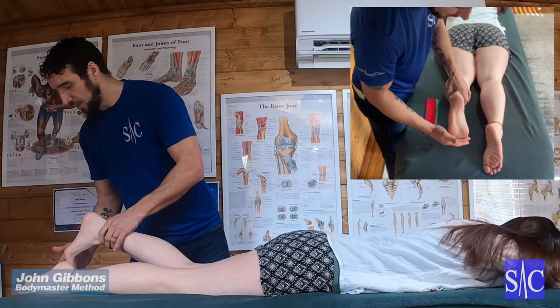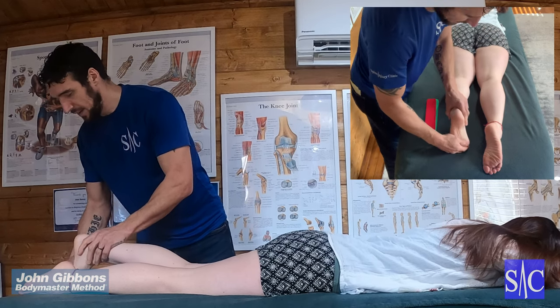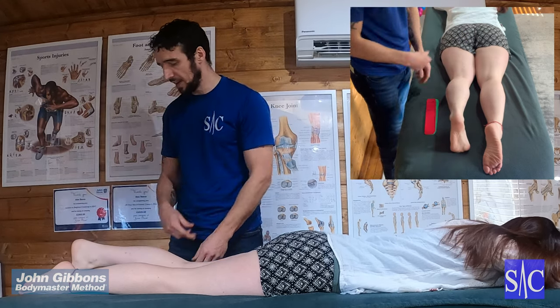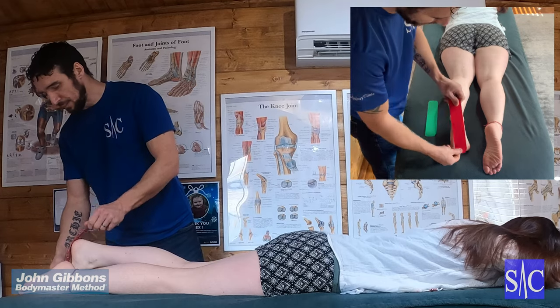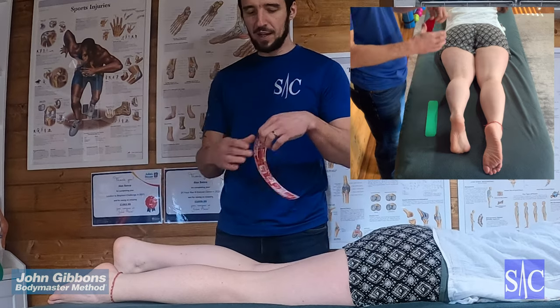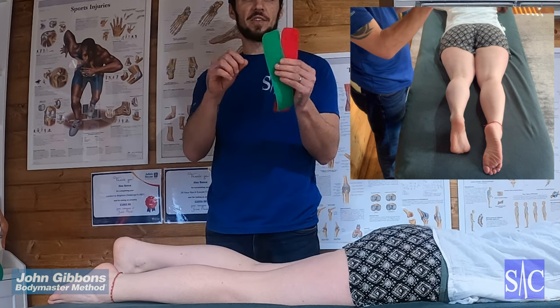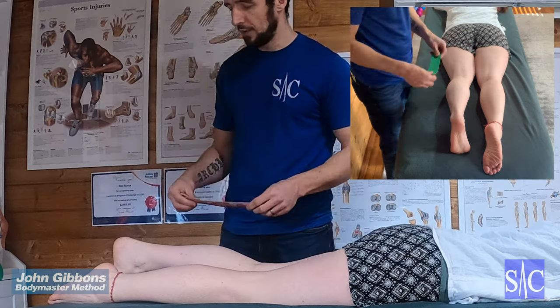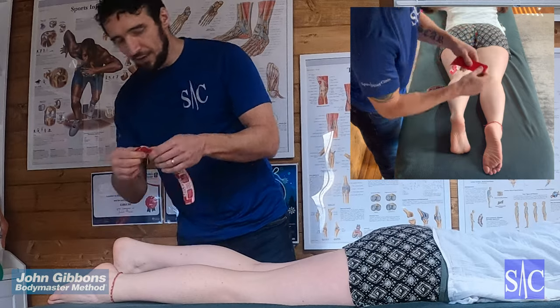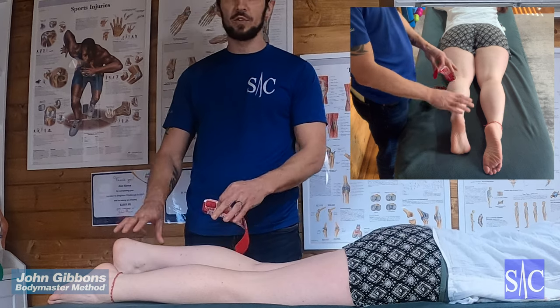Take the affected foot, curl the toes, and then put as much flexion on the ankle as possible to put a stretch all through this area. Then measure the first piece from the ball of the foot up just to above the ankle bones, then cut two pieces the same size and round off the edges — rounding off the edges helps stop it catching on socks and trousers. You should not tape if you've got an allergy to plasters, and if you get any kind of itch, it means you have an allergic reaction to the tape and you should remove it.